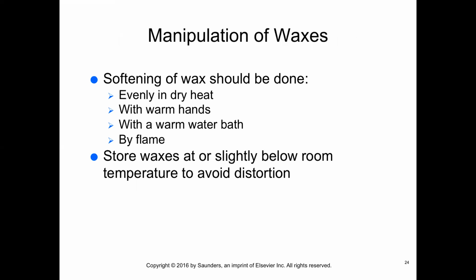When using wax, you should first soften it so it's not brittle. You can use an even dry heat, warm water, flame, or even just your hands. Wax should be stored at or slightly below room temperature to avoid distortion.